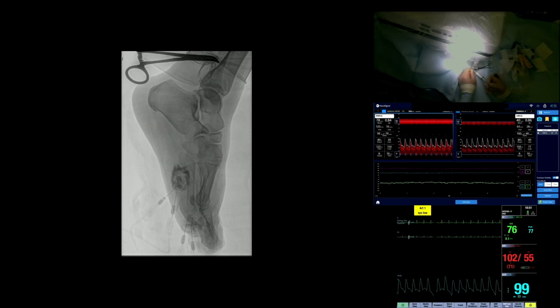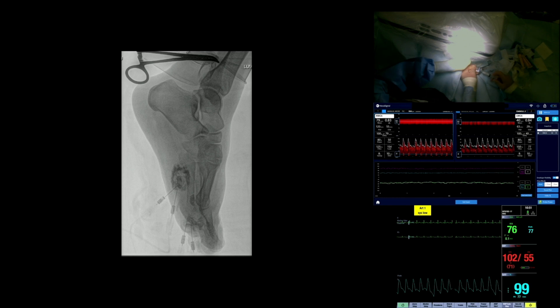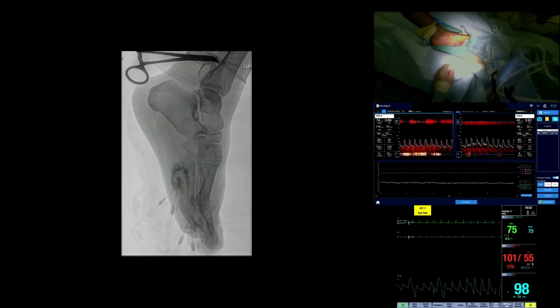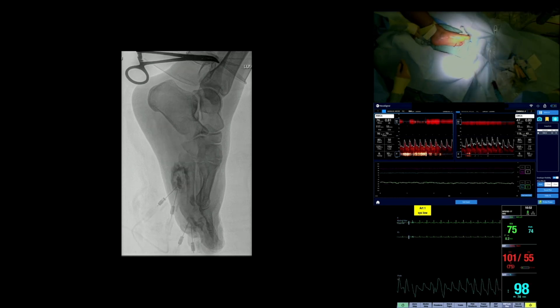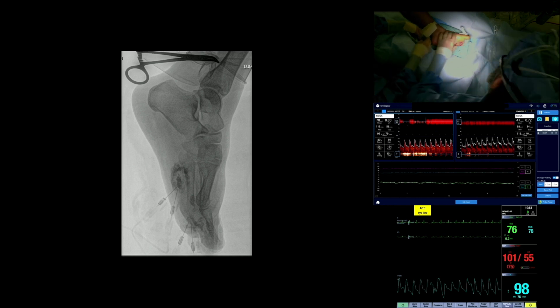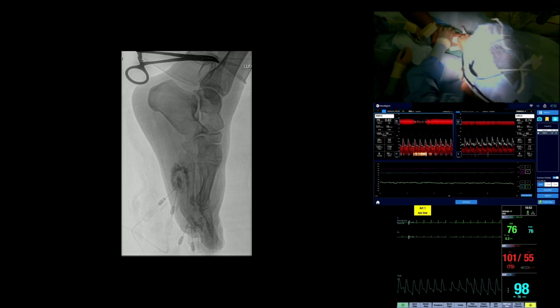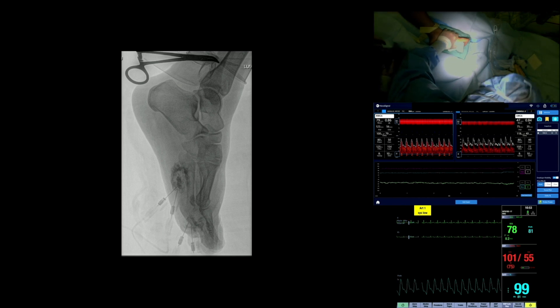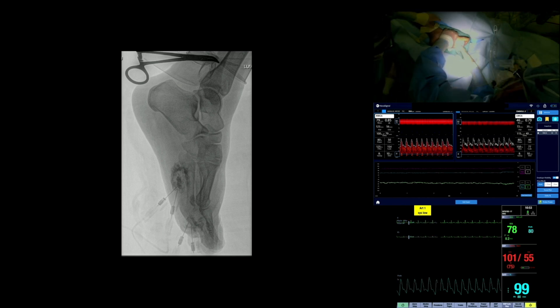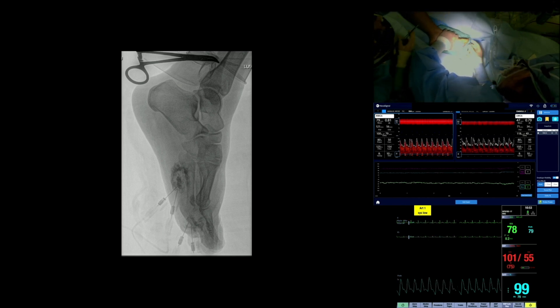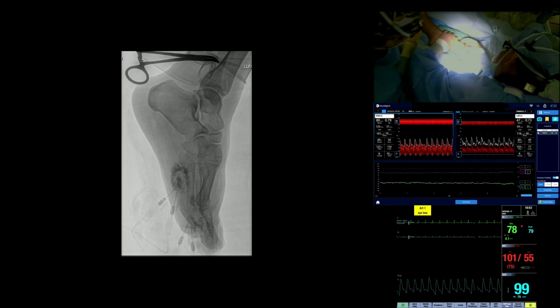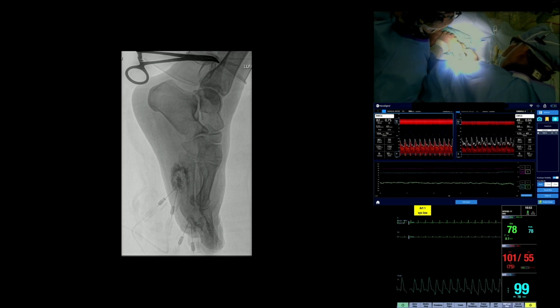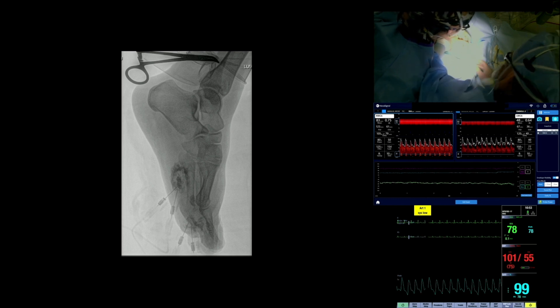We did not see any hits on our TCD monitor. The butterfly needles were removed and pressure was held on the plantar surface for hemostasis. The removal of the tourniquet was a crucial point of the procedure, as STS can reach the cerebral arteries through the PFO. No hits or hyperechoic signals were seen on TCD.